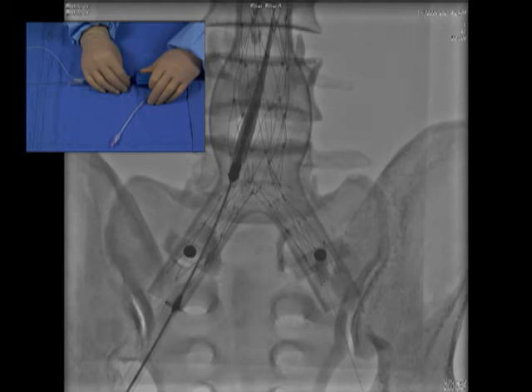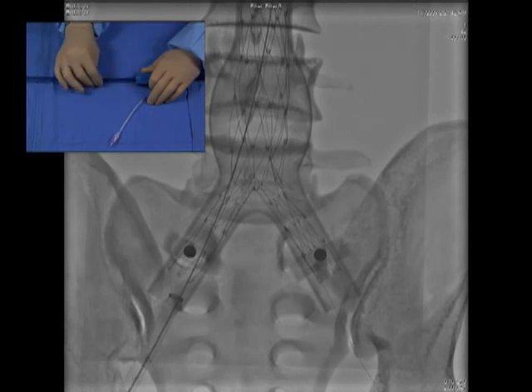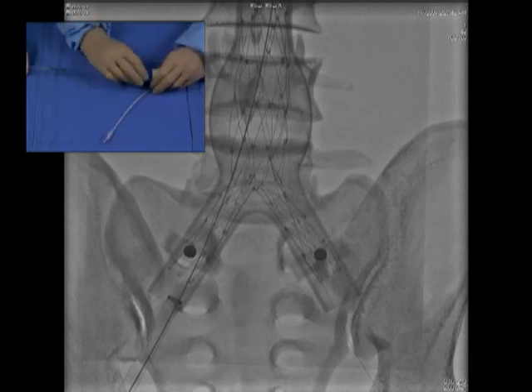Maintain introducer sheath position by holding the retraction hub stationary, then retract the inner core assembly until it is fully removed from the introducer sheath. Ensure guide wire access is maintained during the removal process. Quickly tighten the hemostasis valve to minimize blood loss.